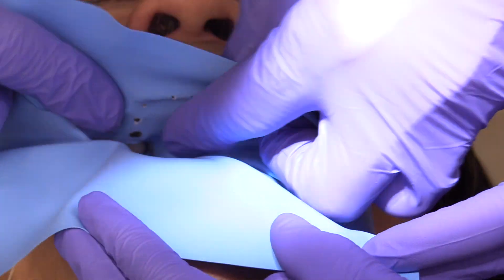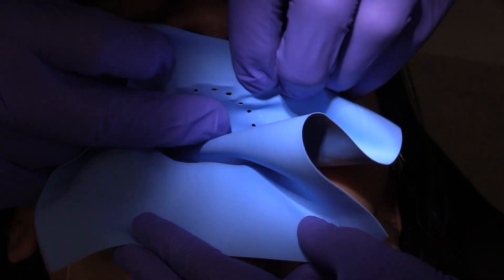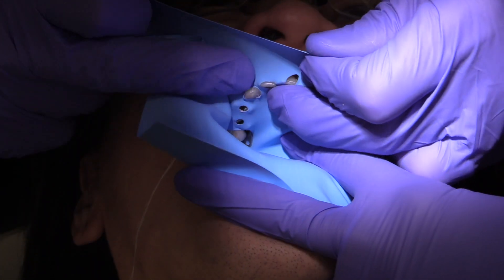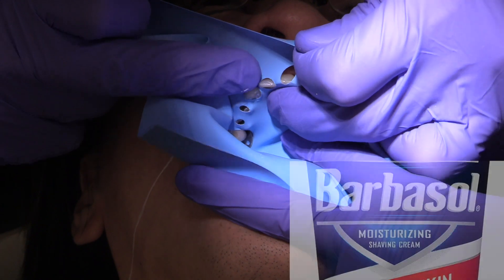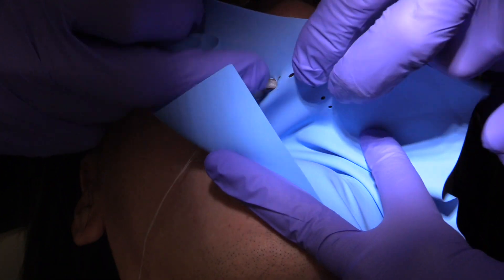I like number threes — they fit really well. And we're using a medium weight Nick Tone latex rubber dam with a little bit of lubricant between the teeth and the rubber dam to facilitate the placement of the rubber dam.